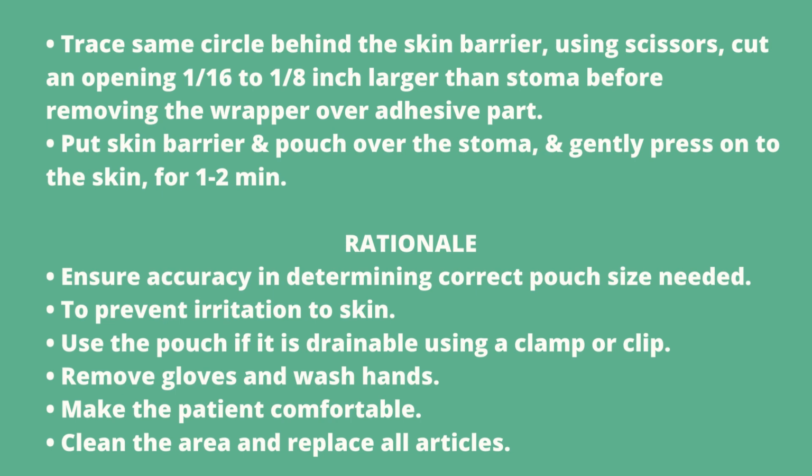Okay, put skin barrier and pouch over the stoma. जो स्टोमा है उसके ऊपर उसको पुट करना है, and gently press on the skin for 1 to 2 minutes. Why we have to press that skin? For attachment of that bag.